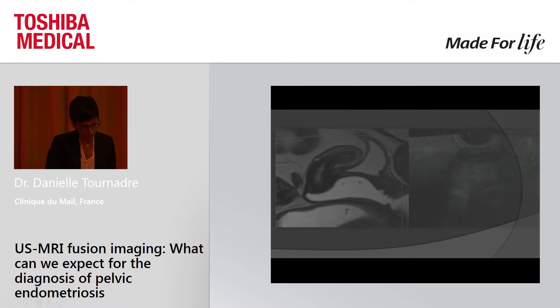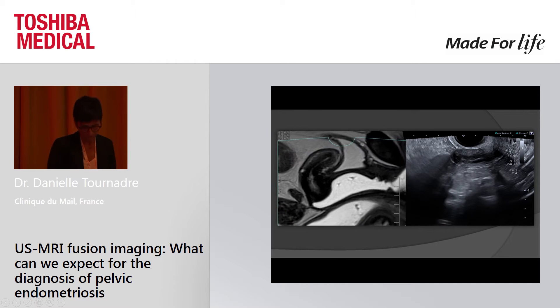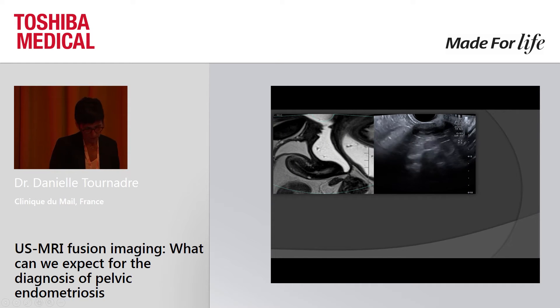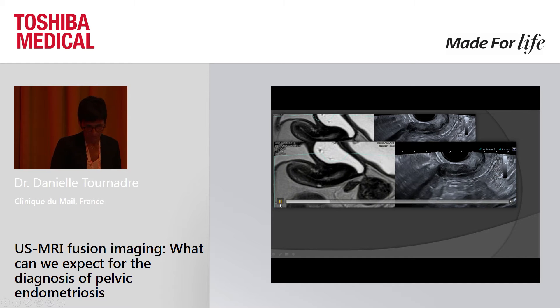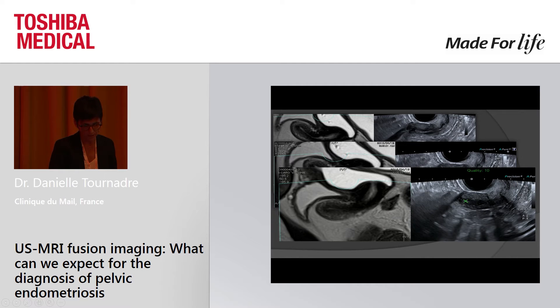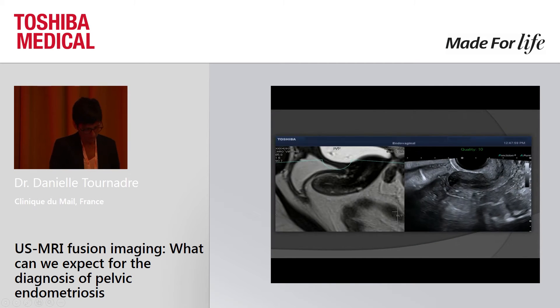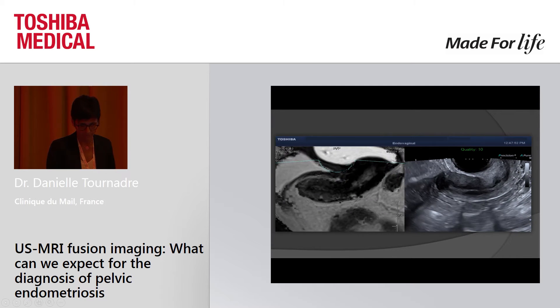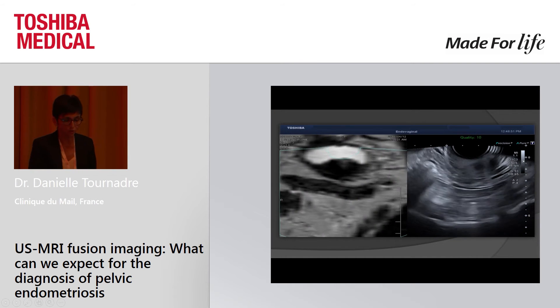You can see the adjustment of the angle of the MRI data with respect to the sagittal plane on ultrasound. Position and angle adjustment of the MRI images and correction of angle are performed. It is then possible at the end of synchronization to place marked points on the uterine contour to perfect synchronization. When synchronization is achieved, we can move easily through the MRI volume with real-time ultrasound scan displayed simultaneously. It is also possible to obtain a transversal plane, though with lower resolution since these are 2D rather than 3D sequences.